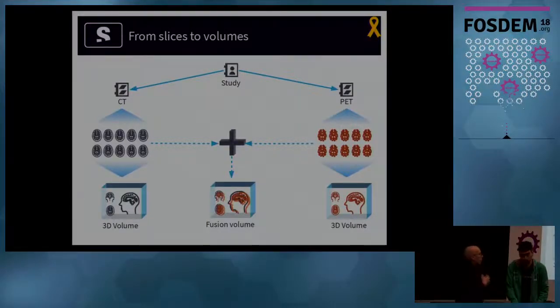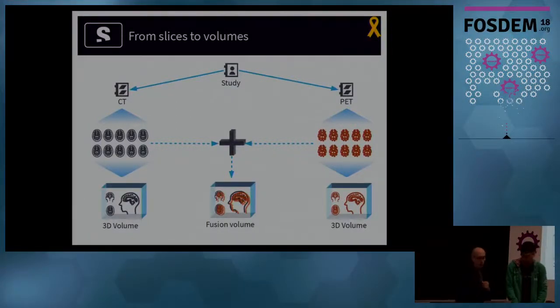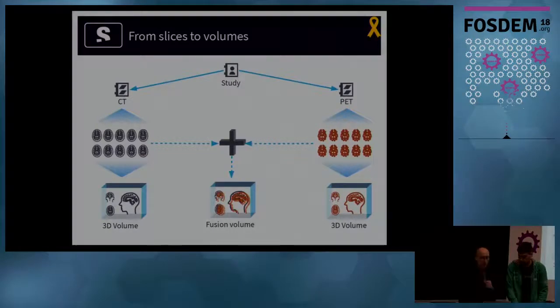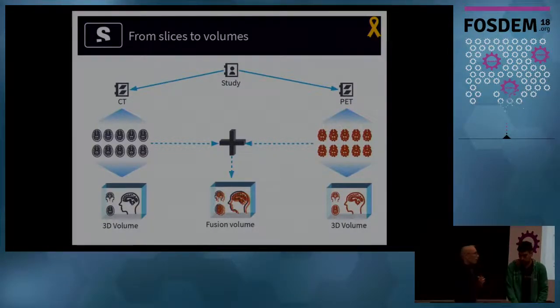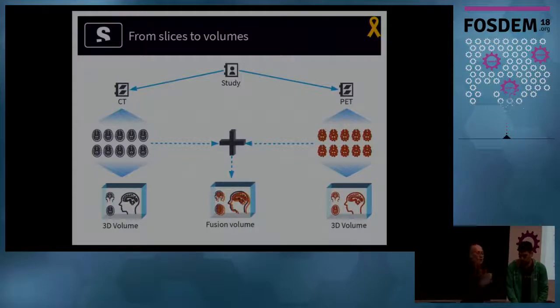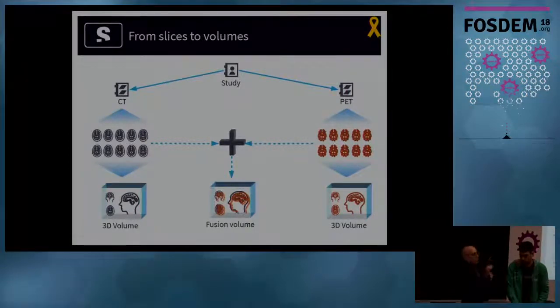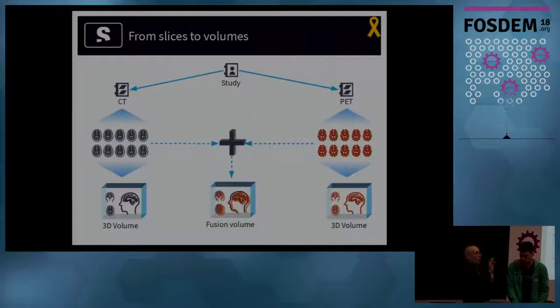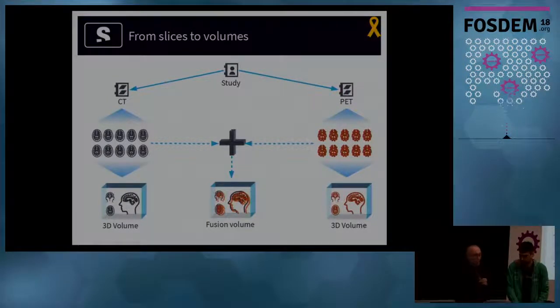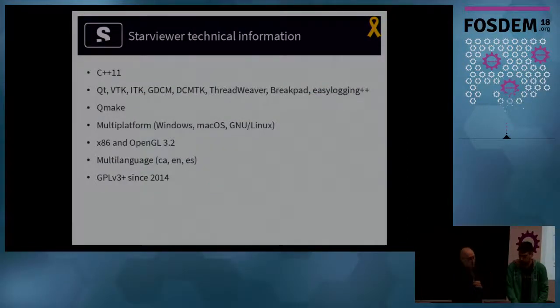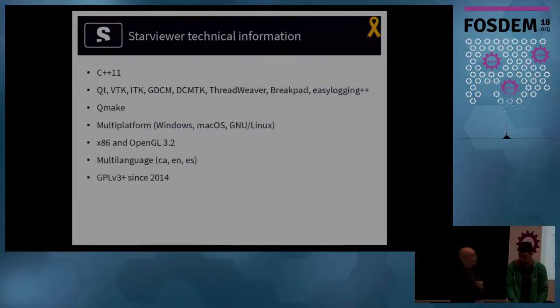In the case of StarViewer, if we also have, for example, a PET image, which is from nuclear medicine, you can overlap them and then, for example, show the parts which are active. This is what we will show in the demonstration.